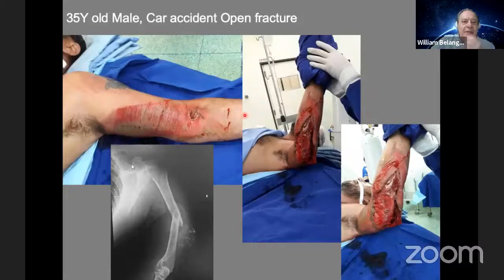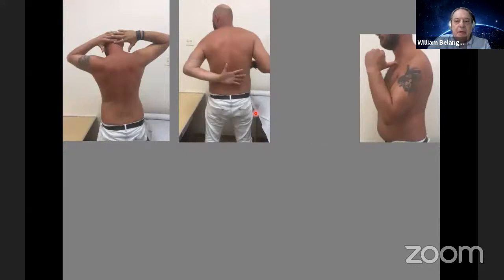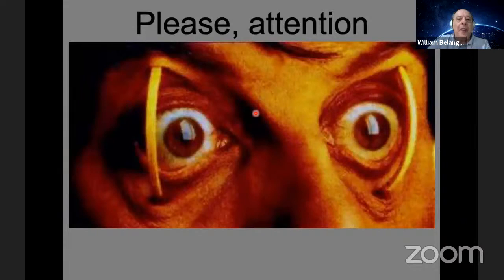This is another interesting case. It's a car accident, open fracture. It's a posterior exposure of the bone. You see, open by posterior, and the focus of the fracture. The patient was taken to the operating room, and after washing and debridement, the anterior fixation was done using this concept. This is the patient's evolution, and the bone completely healed.